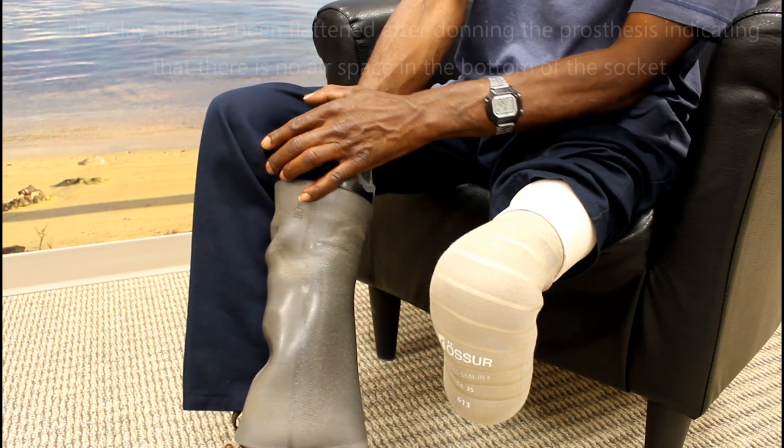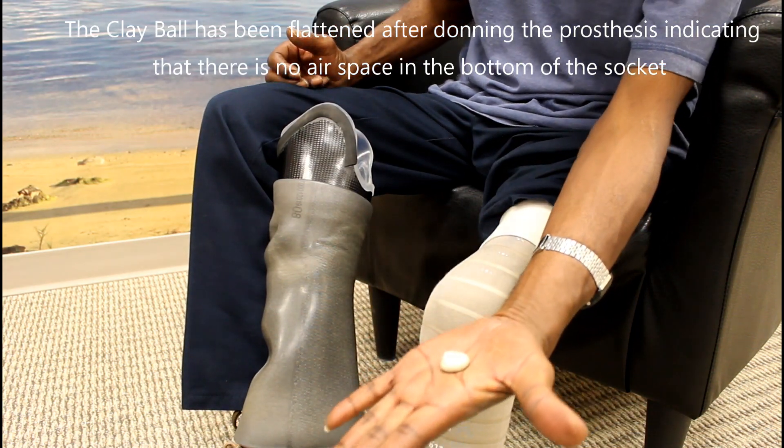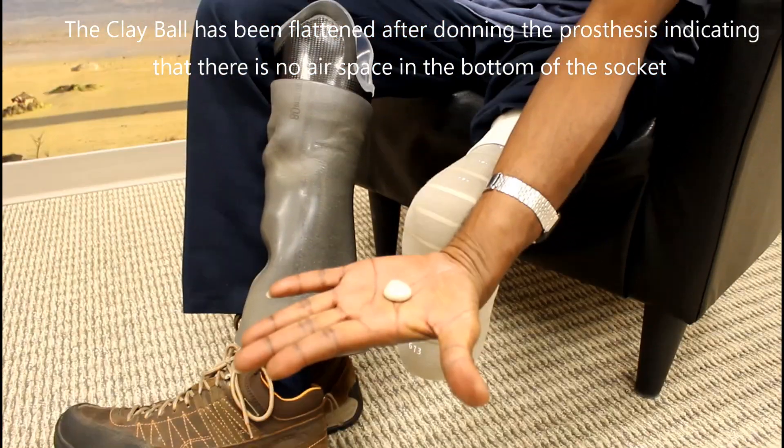If you use clay, make sure not to place the clay over or near the hole and/or valve in the bottom of your socket where it may plug the hole that air is meant to escape through.